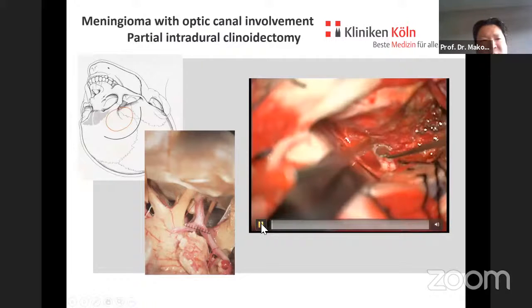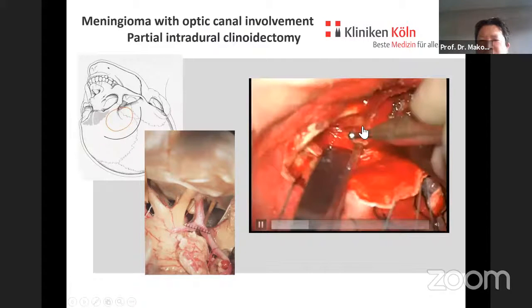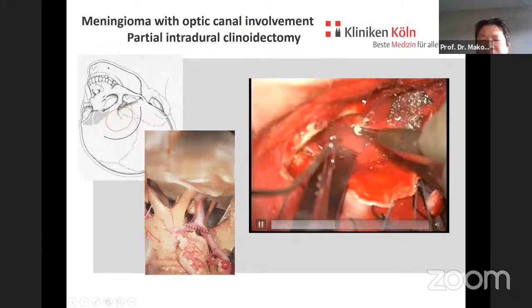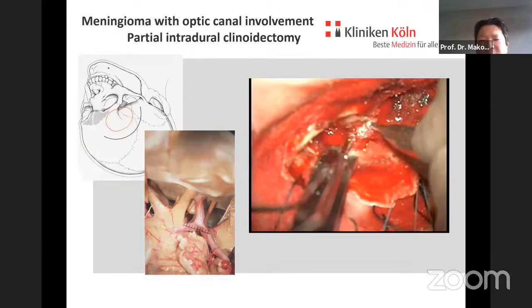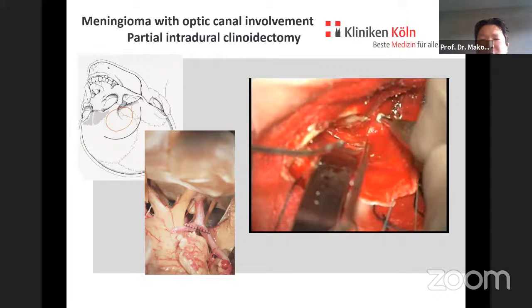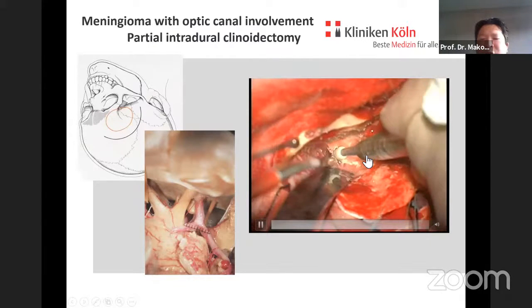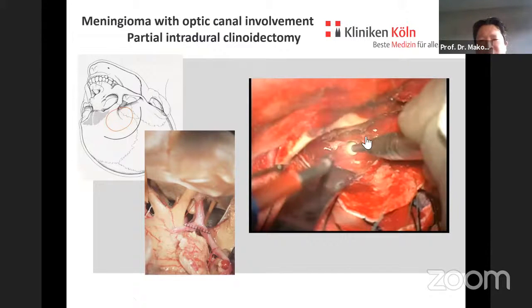So this is just a very short example of a meningioma which is involving the optic canal, where I did a partial intradural clinoidectomy, intraoperative view of the right side. You see the optic nerve and the meningioma. This is the clinoid, which is now drilled, first with the Rosen burr. It's all done intradurally, so just the dura is resected, and now switching to the diamond burr, the cortical shell is just left, and the ACP is now drilled there. This is just the first steps and first sequence of the anterior clinoidectomy, just for an example.